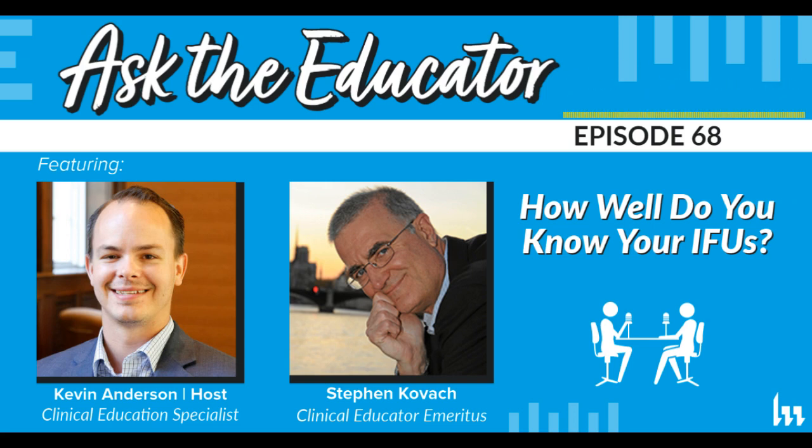So I'm going to help close this with, we got to talk scopes for a minute. And I know I sent you this picture that the majority of scopes have usually two IFUs. One is the operator's IFU and one is the reprocessing IFU. And many times in the sterile processing area, they don't get to look at the operator's IFU. But within that operator's IFU, it tells the operator, post what to do, how to carry the scope, what to look for, even on some of them testing what they're supposed to test for.